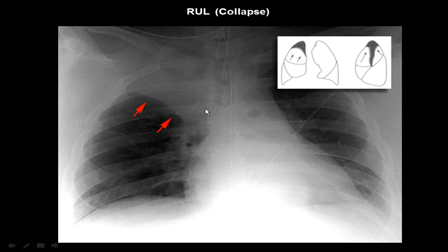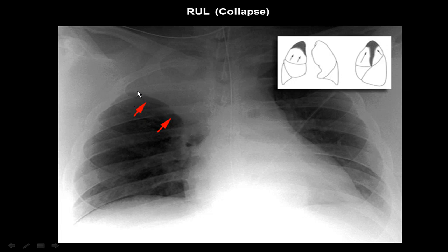This is the right lung — we can see it having some loss of its volume, with white density at the upper lobe. This means right upper lobe collapse: it has lost the volume of the upper lobe, with the presence of a line demarcating the upper lobe from the rest of the right lung. This is right upper lobe collapse.